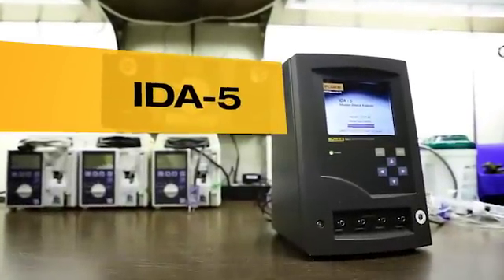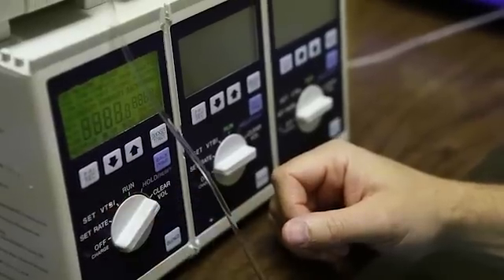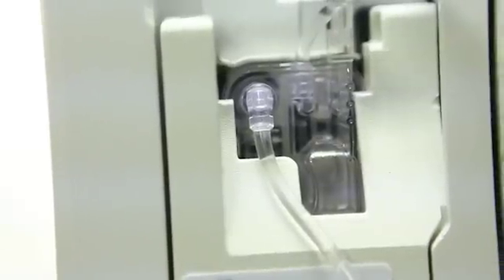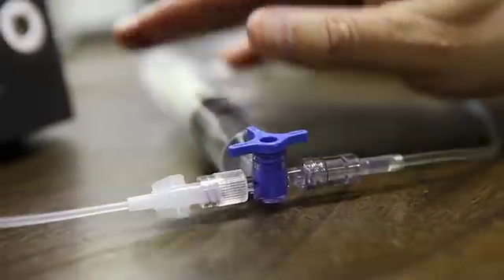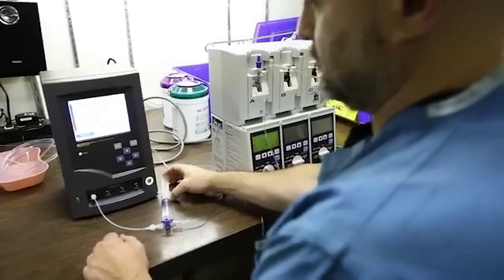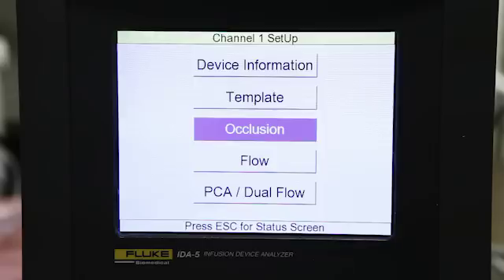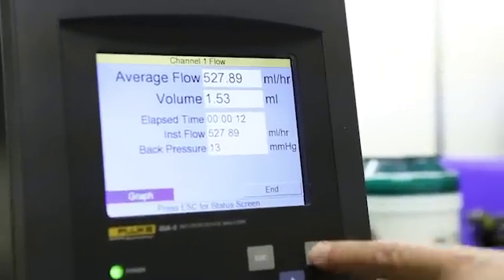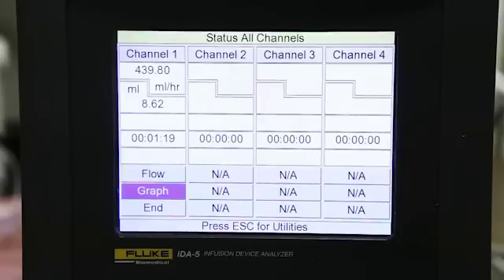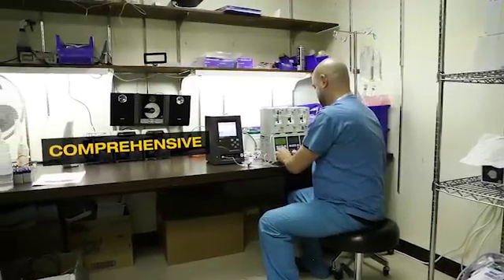The IDA5 is really accurate and fast. We use Huspera infusion pumps. Before we used the IDA5, we didn't have any idea what is the percentage of air. And now with the analyzer, it's way easier to find the exact numbers. You can precisely see what is the volume, what is the flow, and what is the pressure. And then you know if the pump works right or not.